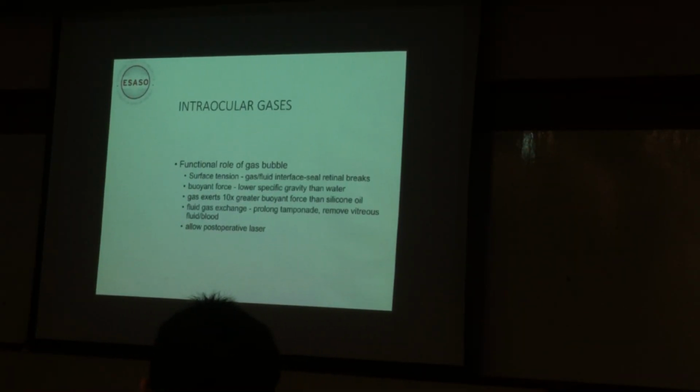So what is the functional role of the gas bubble? Obviously, because of its surface tension properties, it creates a gas-fluid interface which can effectively seal the retinal breaks. Obviously, all gases are buoyant, because they have a lower specific gravity than water, so they will float, they will rise.